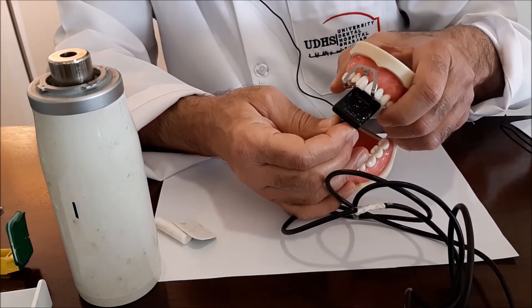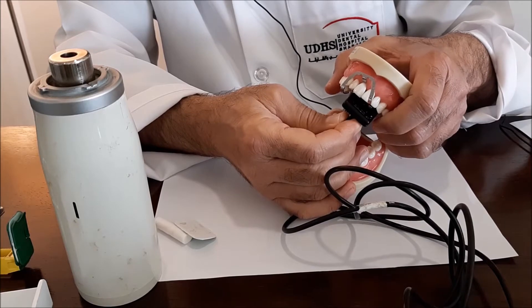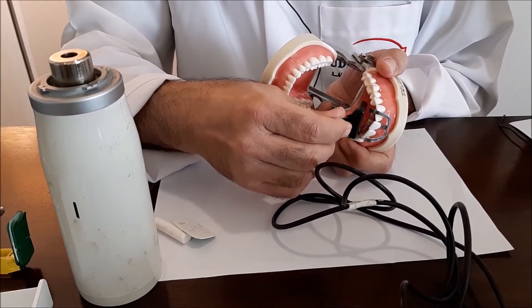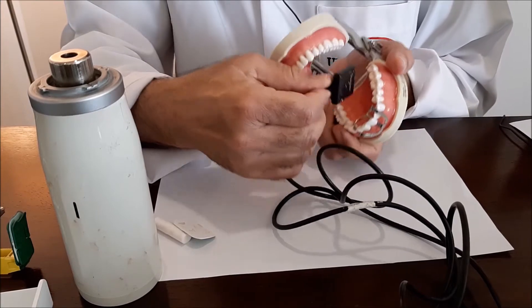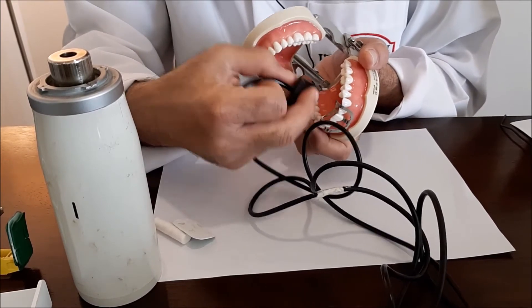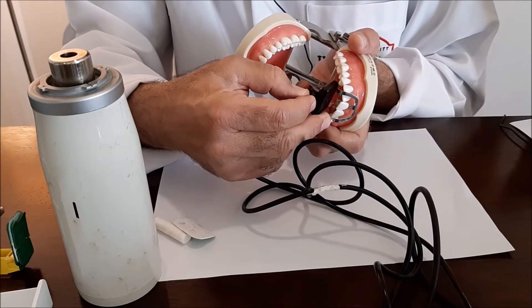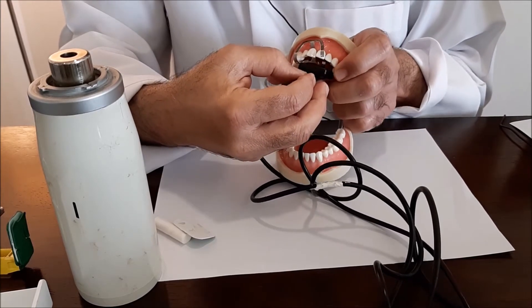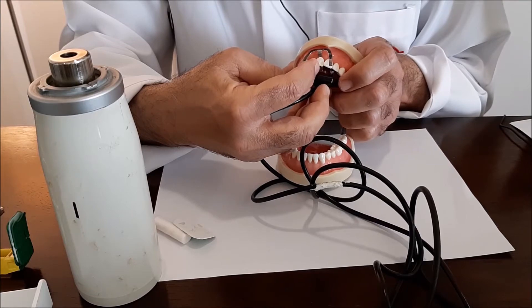What do you do here? First of all, you try to extend the sensor as far as it can go inside the oral cavity. You extend it as far back as it goes so that the upper part of the sensor comes closer to the apex. Sometimes the palate does not allow extending it straight inside the oral cavity, so what you do is make it slanted — instead of placing it flat, you slant it and extend it backwards — so that only about two millimeters of the free margin of the sensor will be extending below the incisal margin.